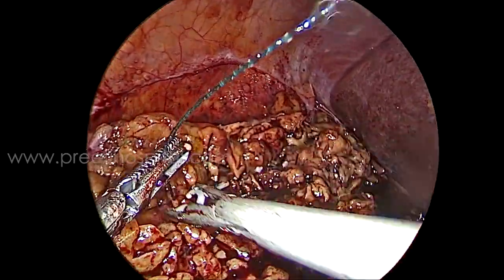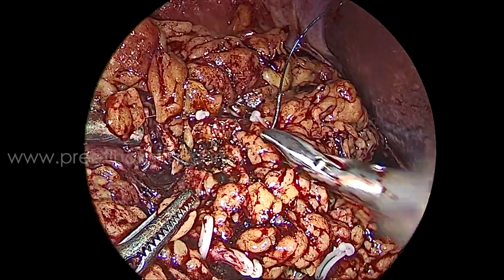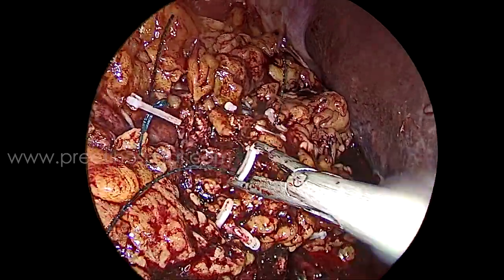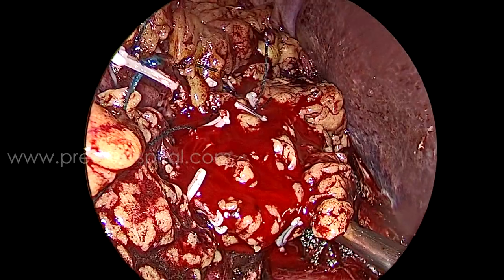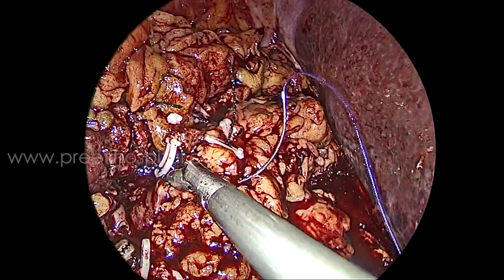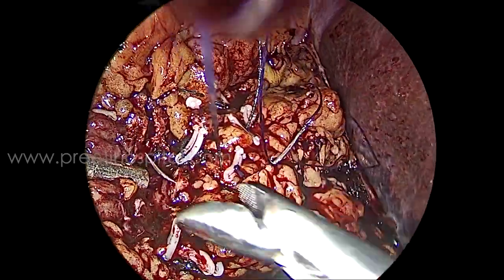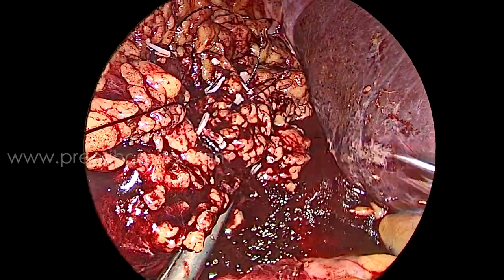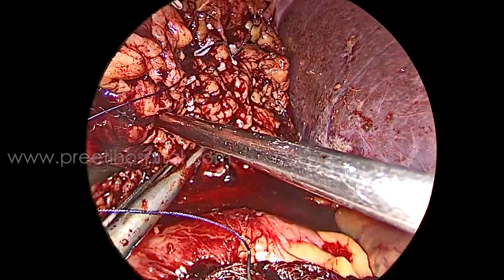Three-dimensional CT reconstruction with artificial intelligence in future will help in these cases — telling you at what level from the hilum to cut. Otherwise with routine CT you have to be really good in reading and implementing it. See here, one vessel at the center was bleeding — we quickly clamped it, a clear area at the center, and we used 2-0 Vicryl for rescue stitches. Sometimes 2-0 Vicryl has better sliding property than V-lock, which has resistance. Two-zero or 3-0 PDS is also very good.